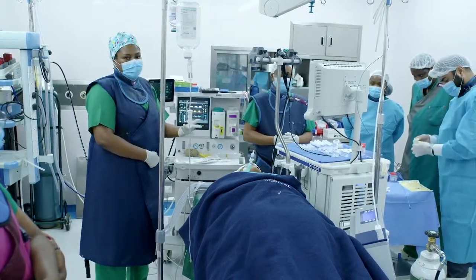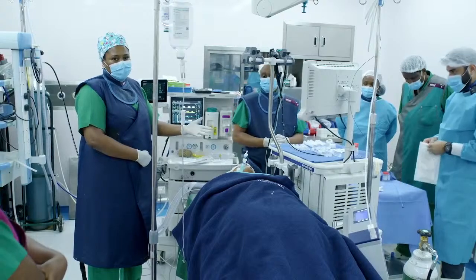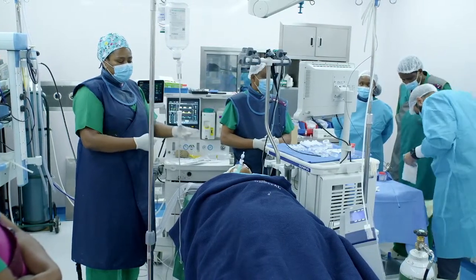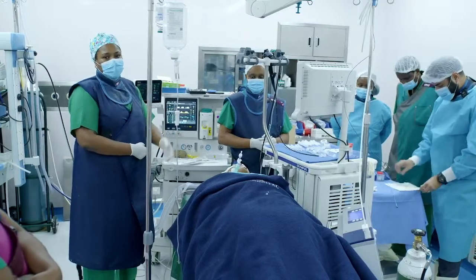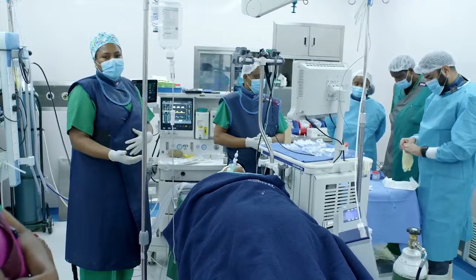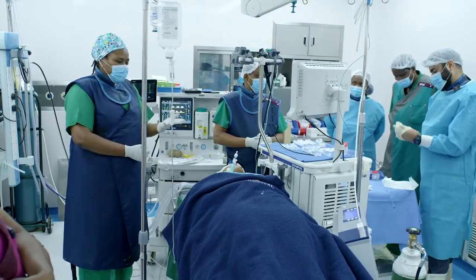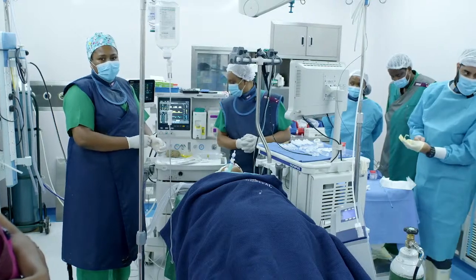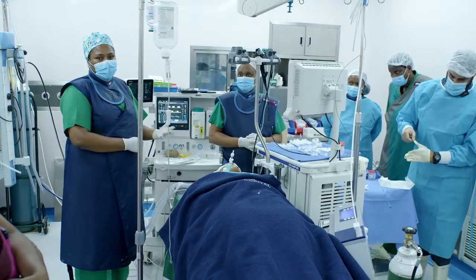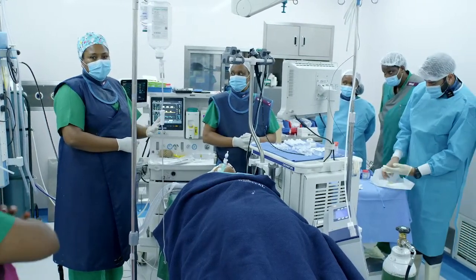The other thing is, because we're sharing the airway, once we start, ideally the patient should be spontaneously breathing, so that because we will be interrupting the flow from the anesthetic machine, at least we maintain the patient oxygenated. The other consideration is the cryo is high energy, so there's a risk of other tissues being damaged. So you look at your airway as the procedure is going on, and you look out for bleeding.